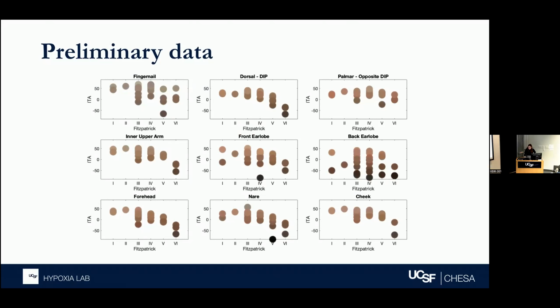For our purposes right now, we're more interested in where the pulse oximeter is placed, such as the nail, dorsal finger, palmar finger, but still a lot of variability across these sites and can vary depending on where we measure and light going through and all different things like that.